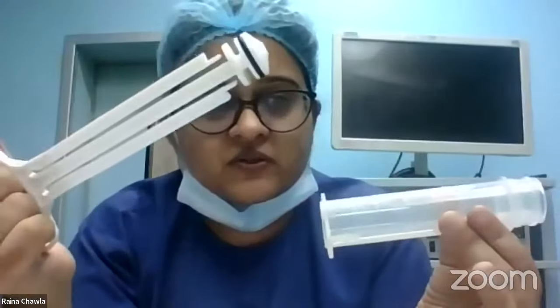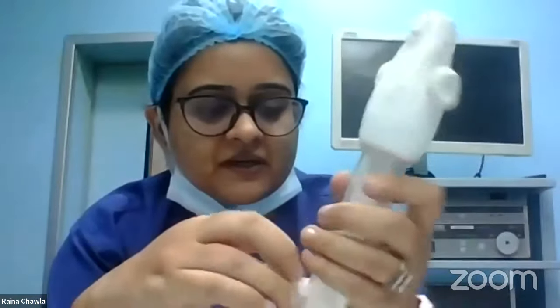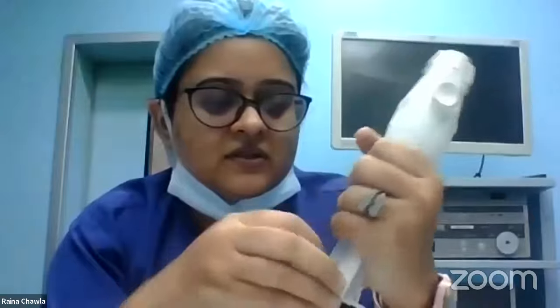This has 3 parts. It has the part which has the valves which creates the suction, the syringe, and it has a lock here, and the plunger. So what do we do when we have to do a manual vacuum aspiration? We assemble all the parts. I'll put the lock back here. Initially, after dilating the cervix with misoprostol or with the Hegar's, we introduce the Karman's cannula, and then we create the vacuum in this syringe. How do we create the vacuum? We first press both the locks.